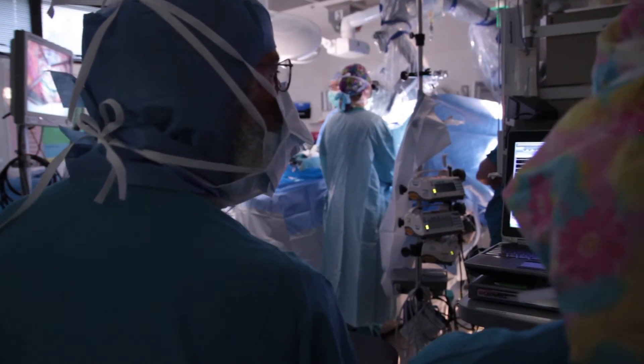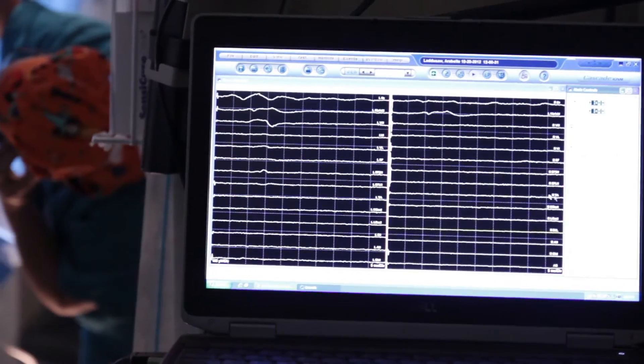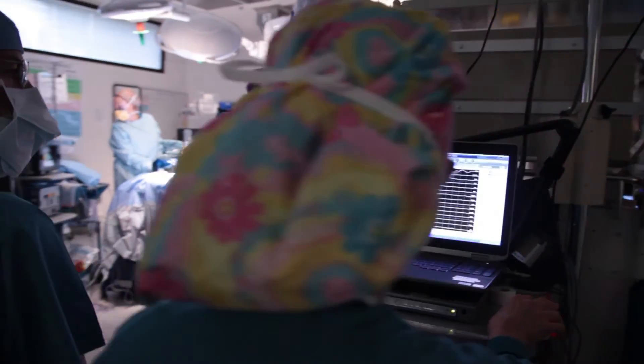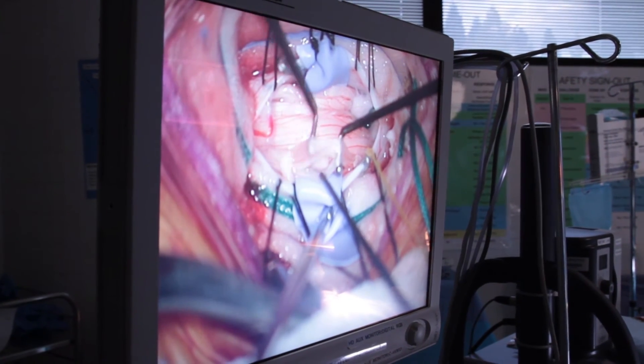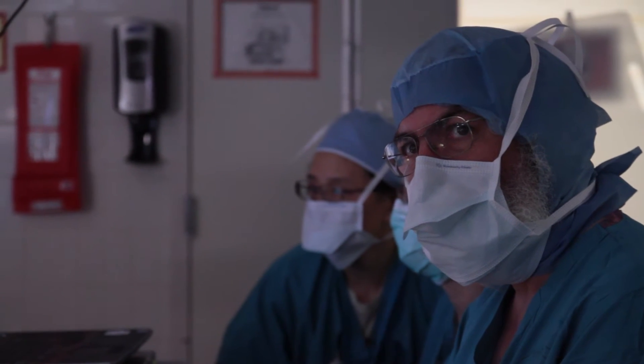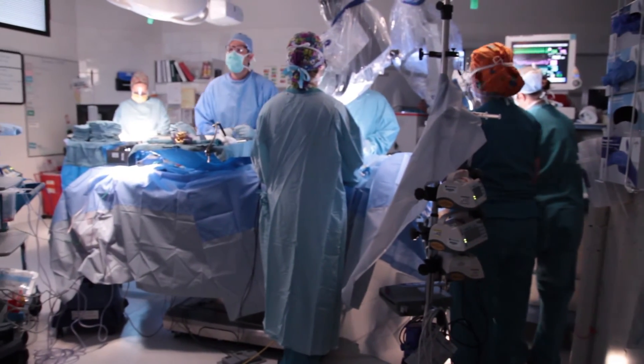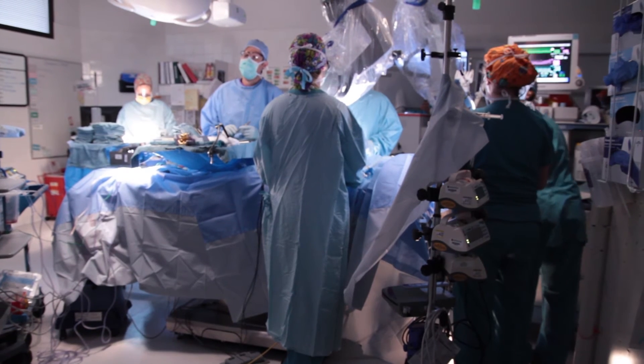As we stimulate one nerve, we have a discussion — is this a motor nerve or a sensory nerve? If it's a motor nerve, we just tuck it away and it's preserved. If it's a sensory nerve, we section it into smaller bundles and each one gets tested. We have this back-and-forth discussion at every time point during stimulation to decide as a team: is this one abnormal enough that we should cut it, or is it okay and we preserve it? That's abnormal — with waxing and waning and some spread.